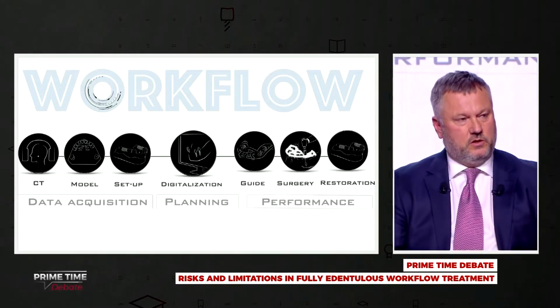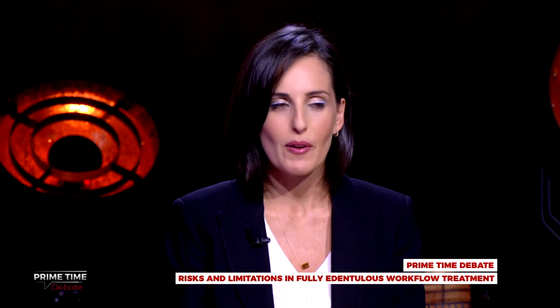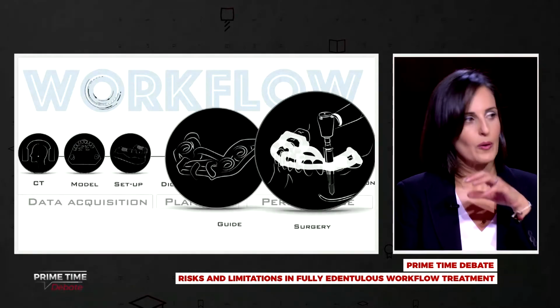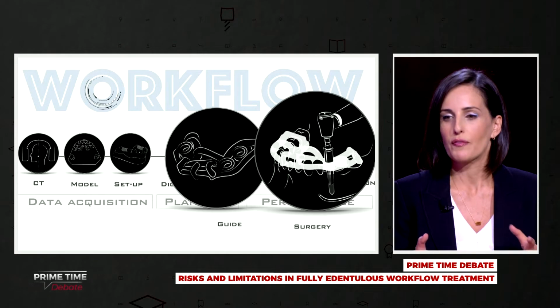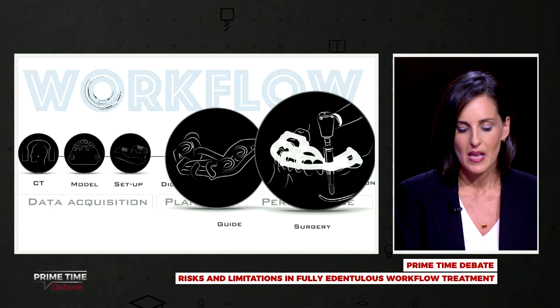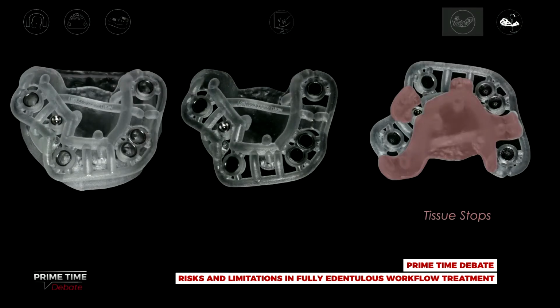Well, first of all, of course, we have the mini implants and or the reference implants also for that stage. Since when we have mini implants, reference implants, instead of having a soft tissue supported case, we are moving to an implant supported case. But there's also another alternative to these mini implants.